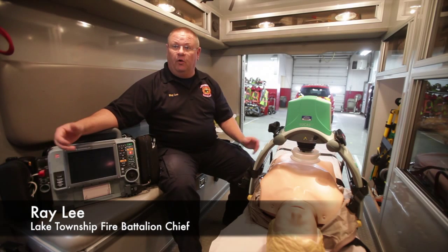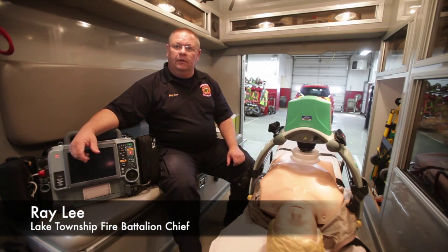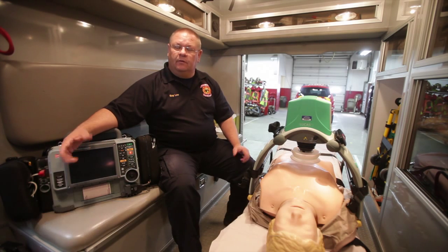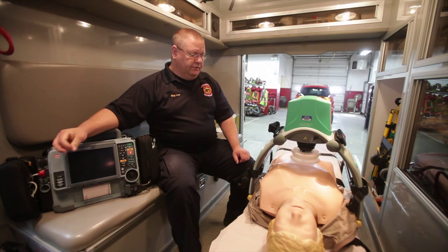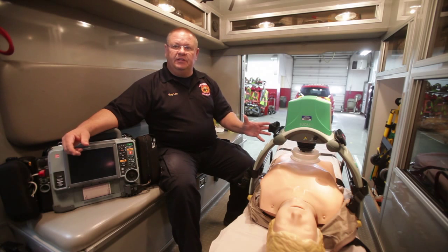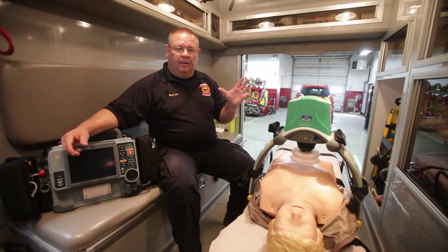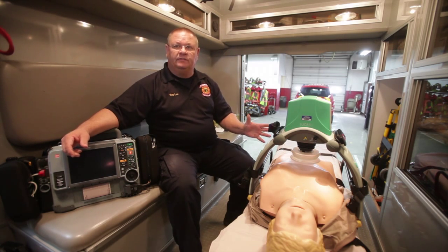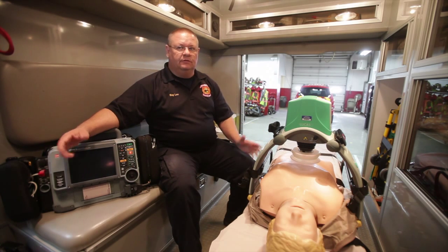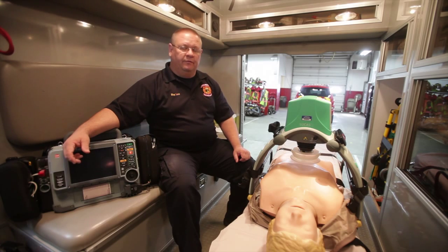The Lucas does CPR for us. It takes the human element out and it does CPR — it frees up our rescuers to do other things. On rescue runs, it translates into good quality, consistent CPR. It allows our rescuers to do other tasks, and sometimes with manpower shortages, it frees up quite a bit of manpower for that.